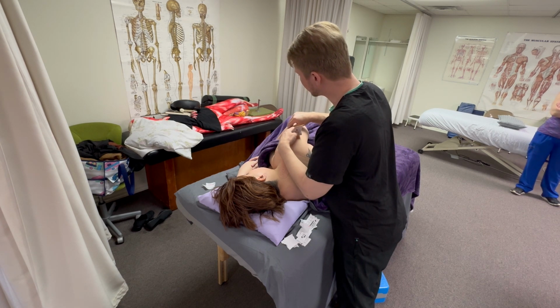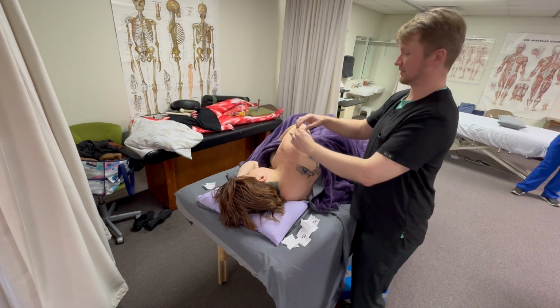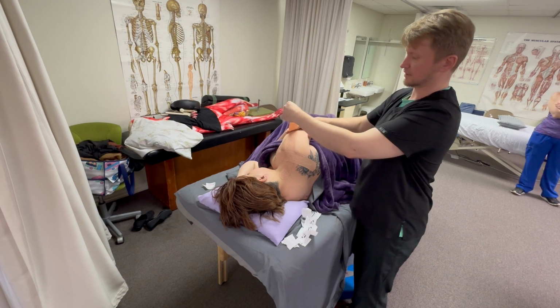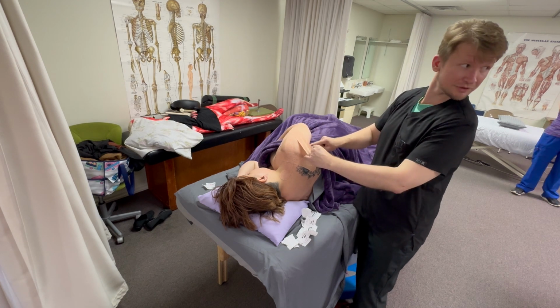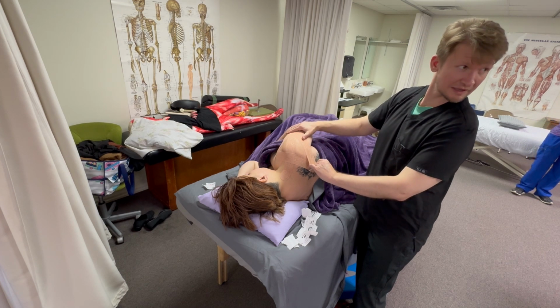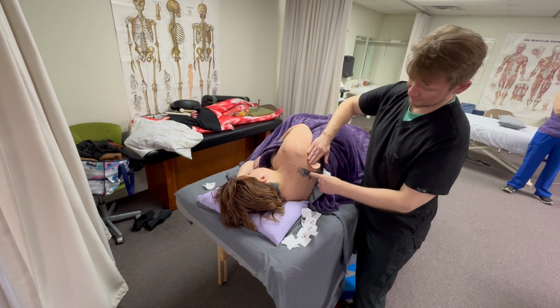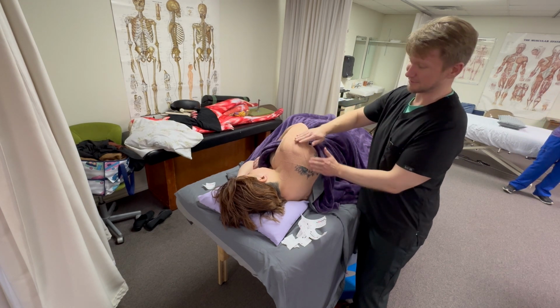Okay. Down past deltoid. That's going to be a well-taped deltoid, let me tell you what. All right, take the backing off again. Okay. I hold the anchor down. Good amount of stretch. And now I kind of just have to navigate around here, right? I know that right about there is where those tendons go. So I'm trying to be infraspinatus, infraspinatus, infraspinatus. This is going to look very precise because the anchors look like they just match right up, but that would not be ideal.